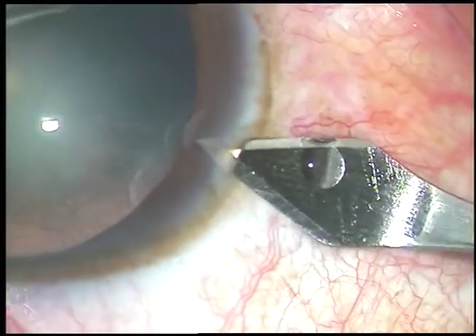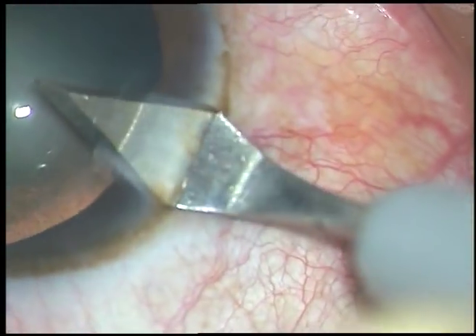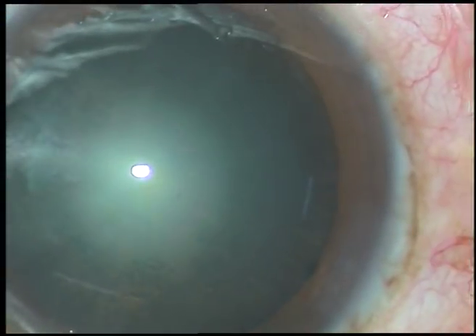This is the main incision exactly at 9 o'clock — a temporal incision, as this is the right eye of the patient.